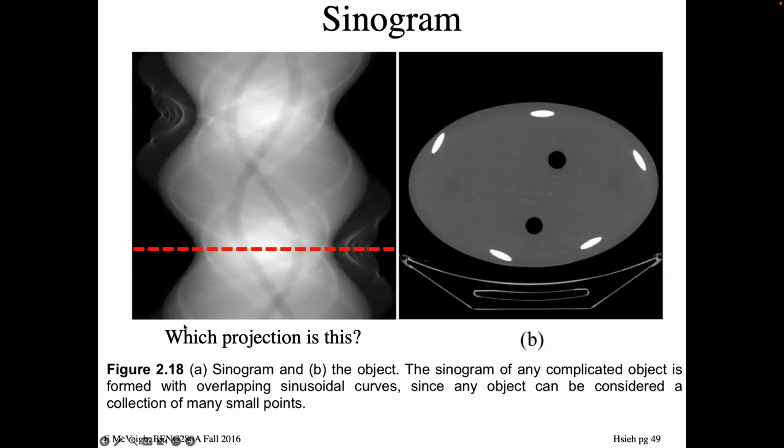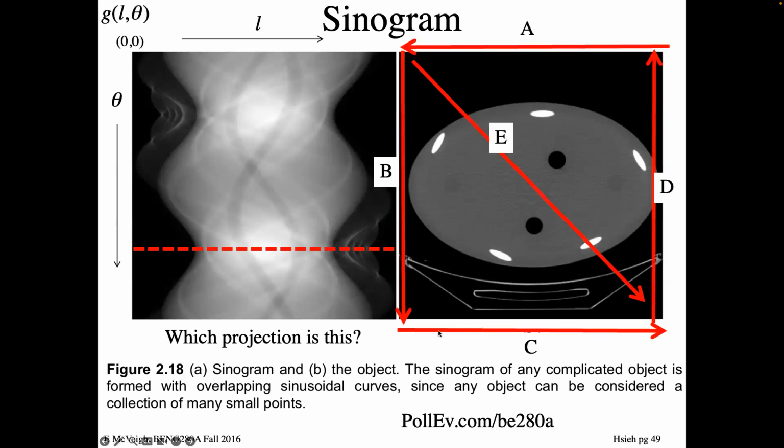If these are large positive values and this is 0, then all this stuff here is the asymmetry. There's only one asymmetry in here that is dominant like that, and it's this stuff. So the detector would start here and go down. This stuff would be at the high value, and the clear side would be down here at the low value. So this is probably that, with this being the high value of the detector. So it would be this one.